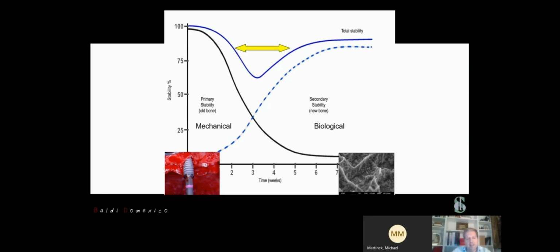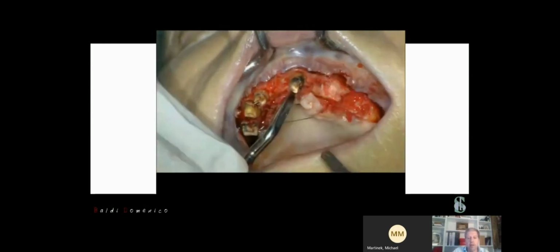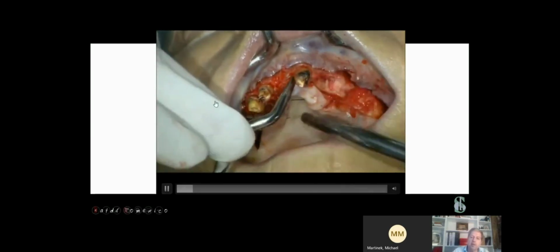The only way to be less invasive is to use an instrument that can help us to obtain a quicker healing of the bone and can permit us to have a good preparation of an implant site in order to guarantee a primary stability of our implants. And here I want to show what we did. So in this situation, we use a traditional lever.